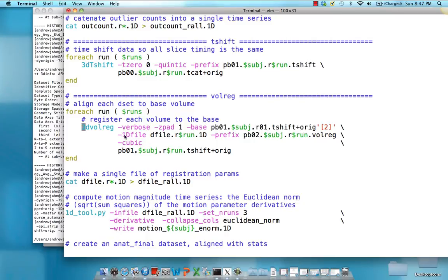The 1D file is a text file with six columns showing the amount of discrepancy between each TR in the X, Y, and Z coordinates, and also the roll, pitch, and yaw rotations away from that base reference image. All of those are concatenated together and output into the dfile_rall file.